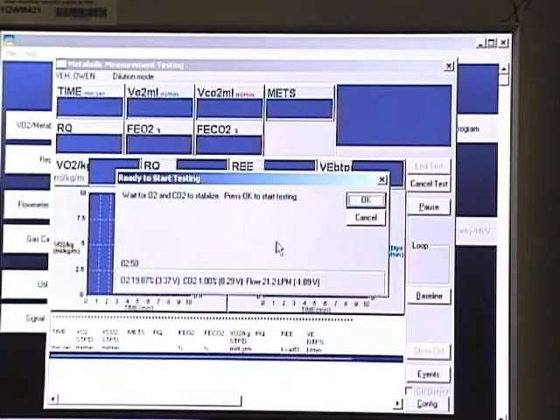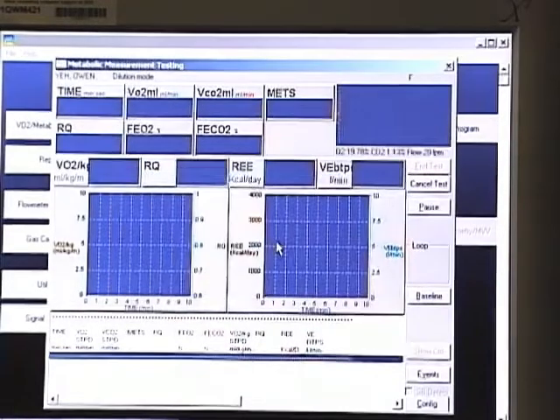We wanted the diluted CO2 concentration to be between 1.0 to 1.2% because we calibrate the system's CO2 analyzer at 1%. So right now CO2 is 1.11%, 1.12%. So we have reached our goal to start the metabolic testing. And I will press spacebar.